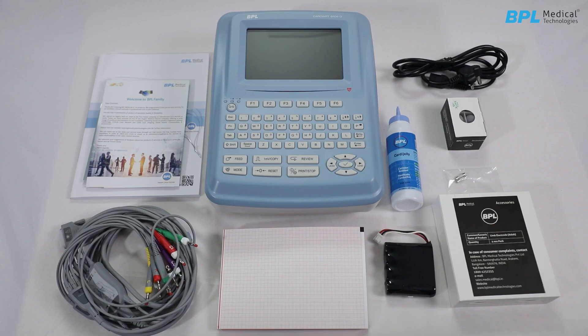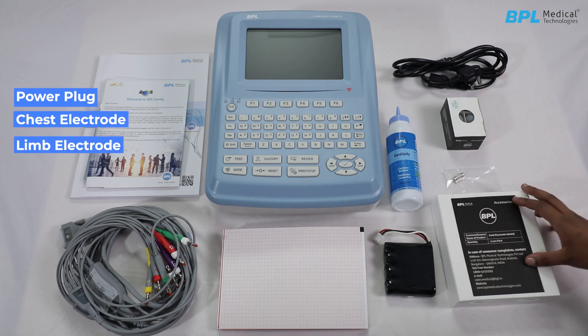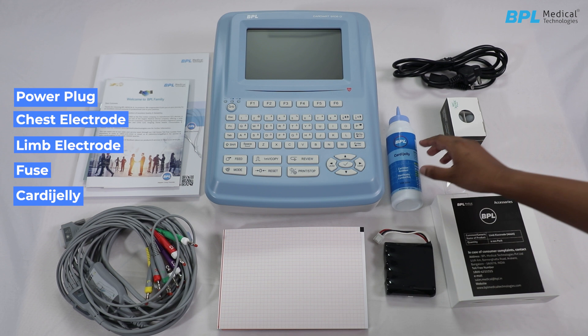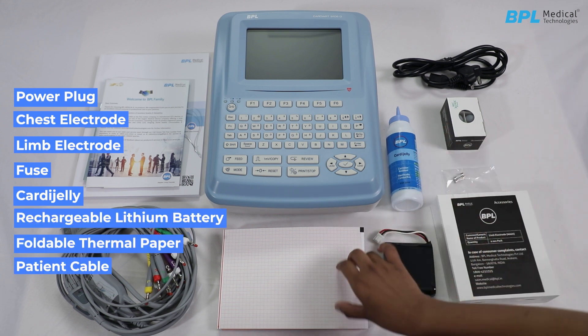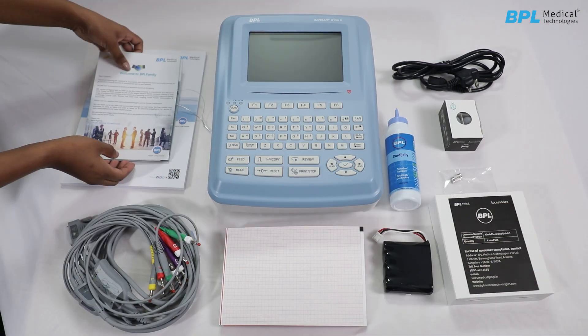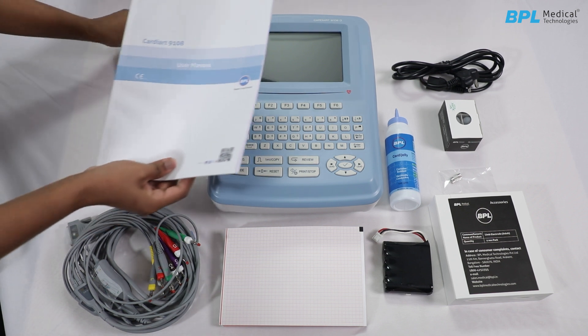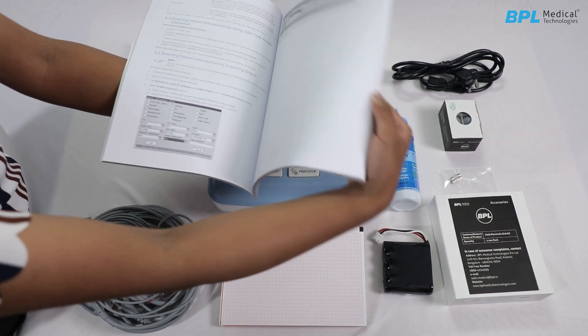The standard accessories provided with the machine are: power plug, chest electrode, limb electrode, fuse, cardiac jelly, rechargeable lithium-ion battery, foldable thermal paper, patient cable, and user manual. For safety information, read the user manual completely before operating the machine and use only original accessories supplied by the manufacturer.